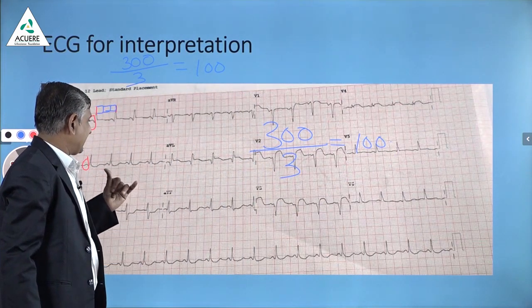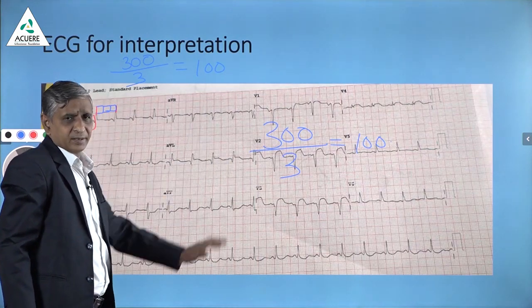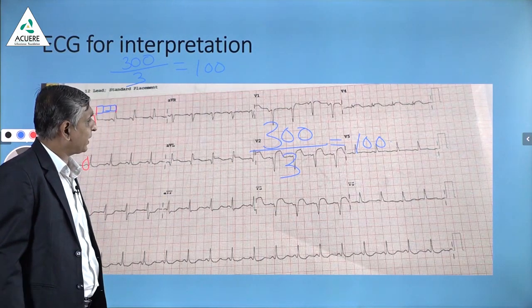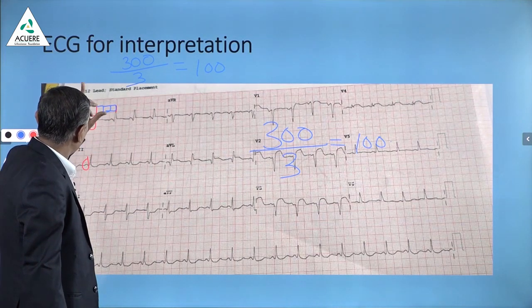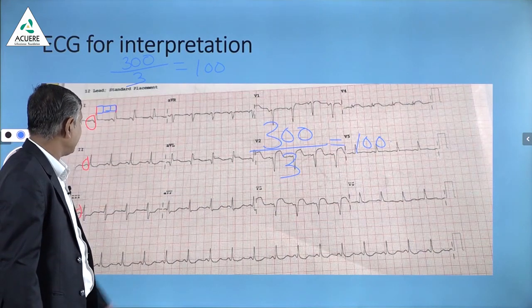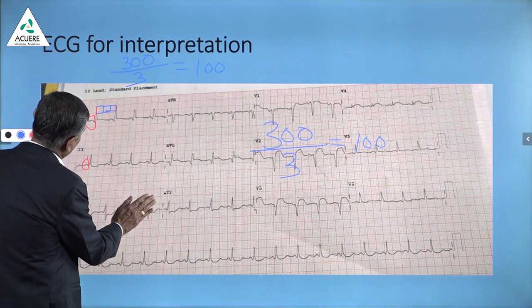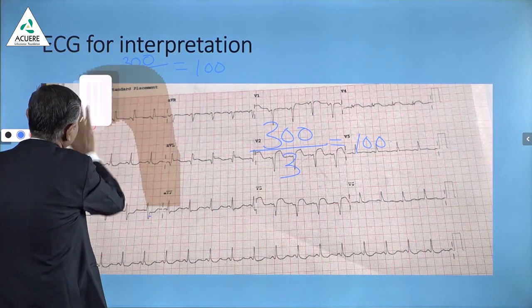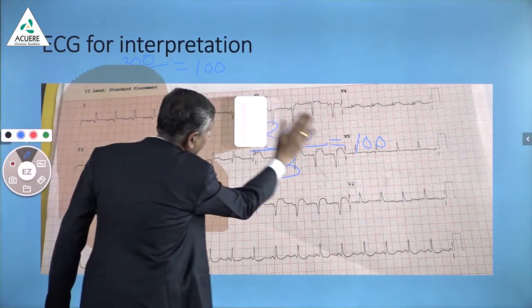The heart rate is about 100, which is on the cutoff value for tachycardia. You may not call it tachycardia, but yes — the heart is beating in sinus rhythm and the heart rate is 100.